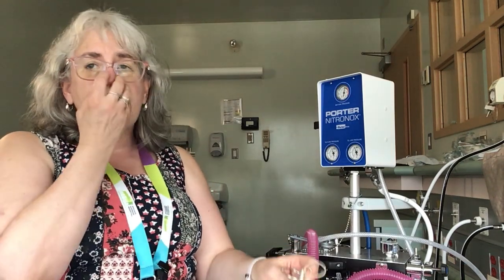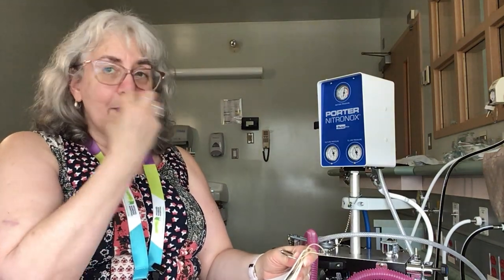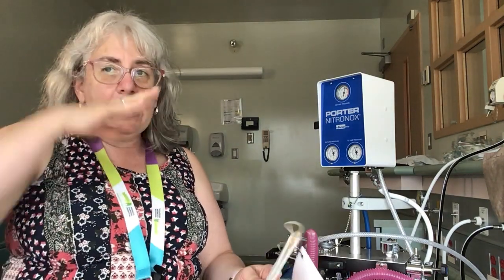They're going to teach them how to breathe during the contraction or the painful procedure, where it's going to be a number of rapid inhalations and exhalations into the mask to bring the level up so that they can achieve a maximal effect. I think it's a peak, maximal effect is achieved around 45 to 60 seconds.